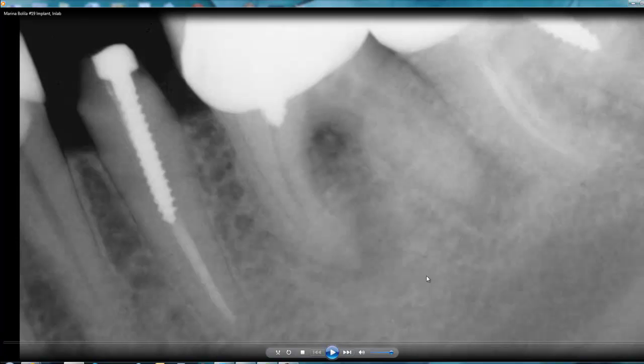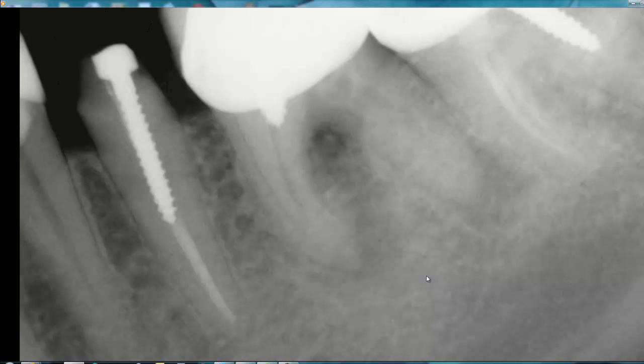Hi, my name is Gregory and today I would like to present the case when I did the implant on number 19 and restored it with an abutment and a crown. So let's start from the beginning.